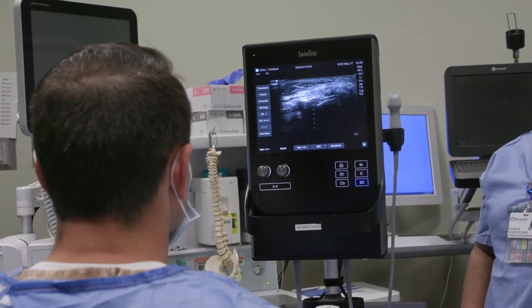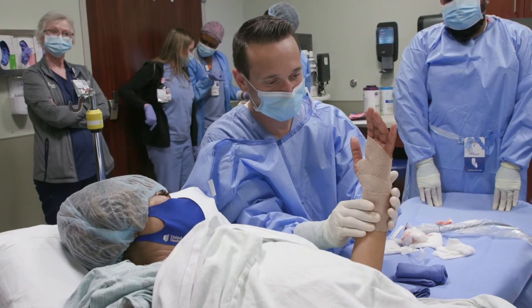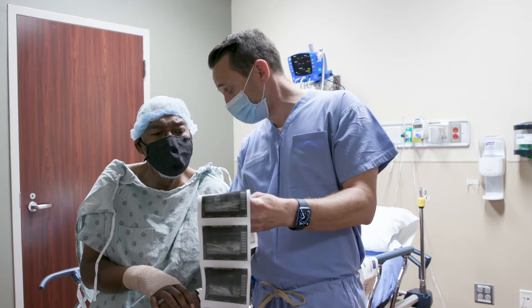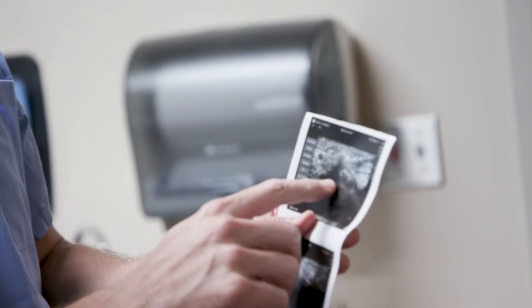The ability to do this under ultrasound guidance and very minimally invasive allows us to have just a few millimeter scar. It's really a major advance, knowing that we don't have to make a large incision and have general anesthesia and many weeks if not months of therapy and rehab and those types of things.